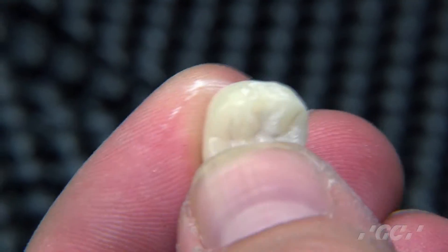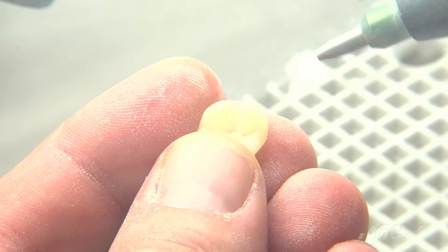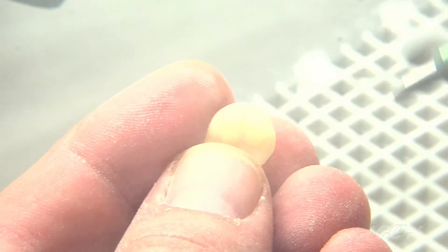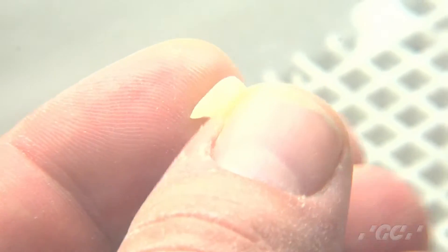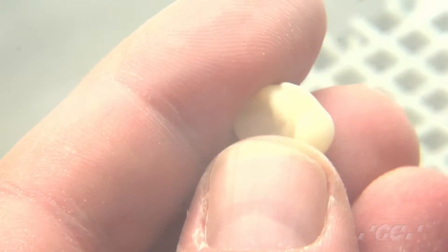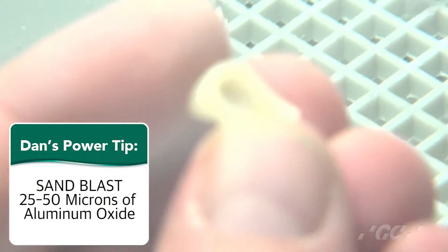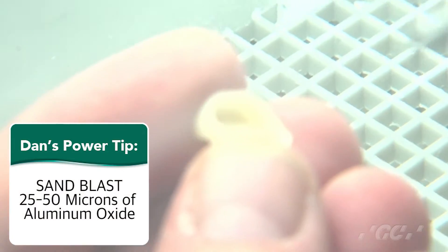Now we're ready to sandblast the surface and the intaglio. We're going to sandblast the entire surface of the Cerismart restoration very gently, not getting too close to the margins, to give an even consistency at around 25 to 50 microns of aluminum oxide.